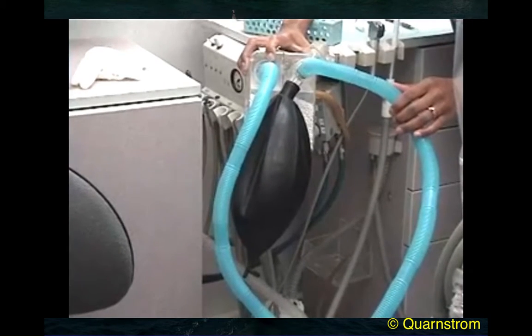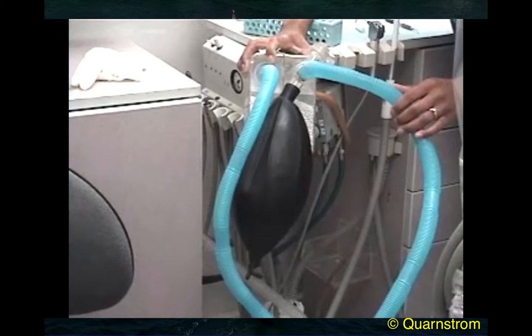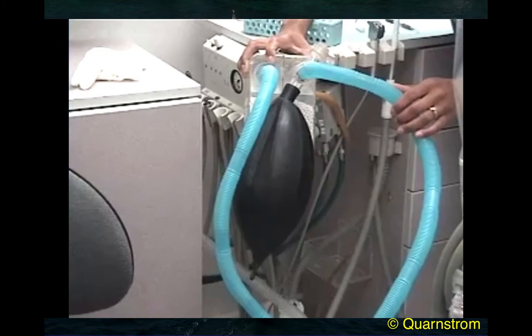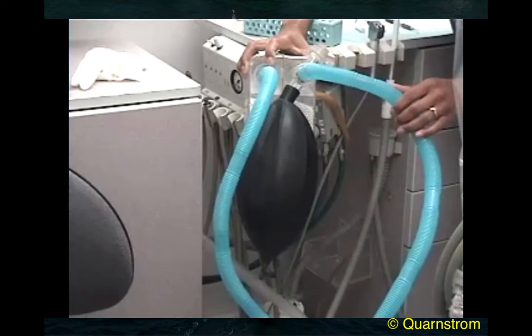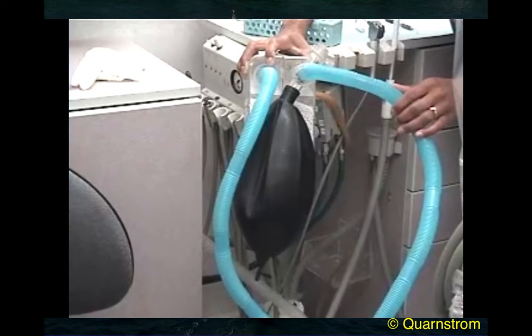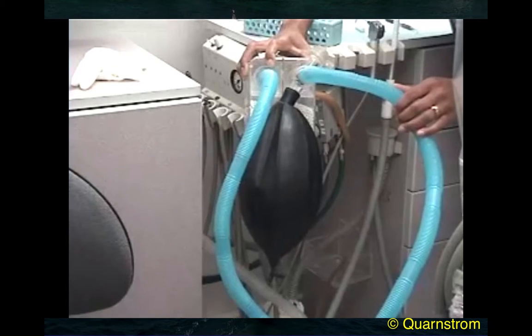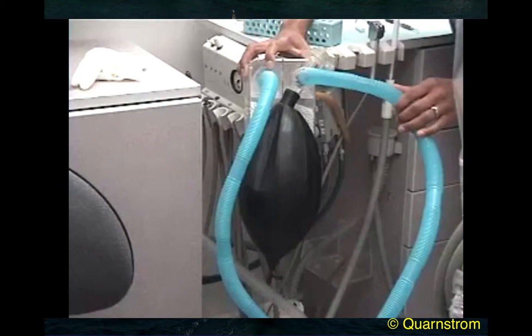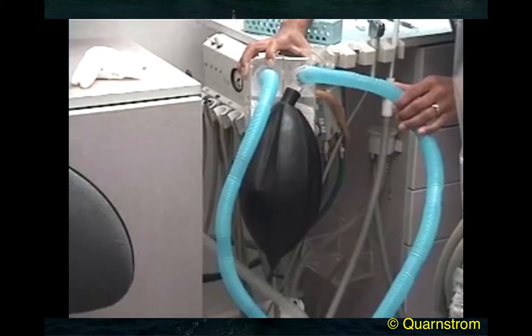Another indicator of breathing has to do with the reservoir bag that's moving in and out. There's been several studies to prove that you can't reliably tell if a person is adequately breathing just by the fact that the bag is moving. If it were moving this much, we'd be pretty sure she was breathing very well. With this much movement, you really wouldn't know if that were adequate for her. So you can't reliably use the reservoir bag to tell just how much a person is breathing, or if they're breathing an adequate amount. You can only say something about the rate of their breathing.